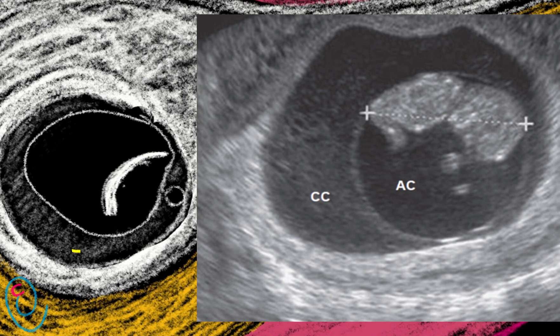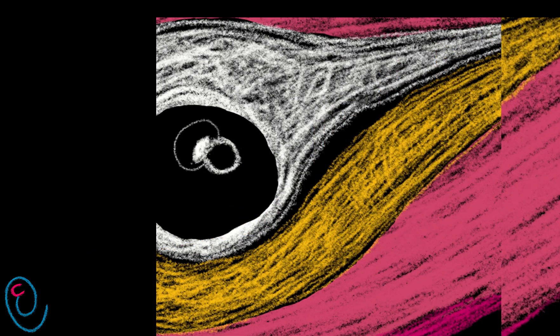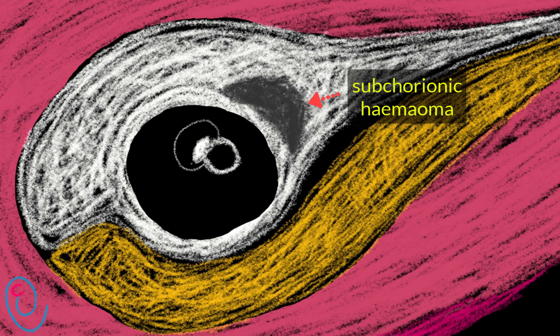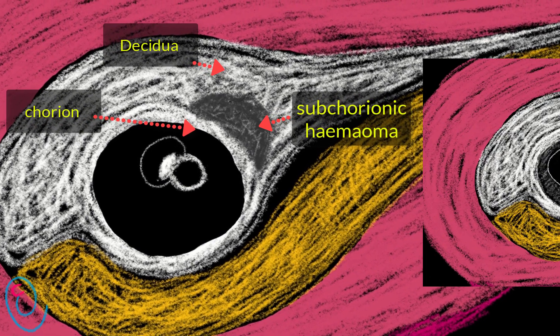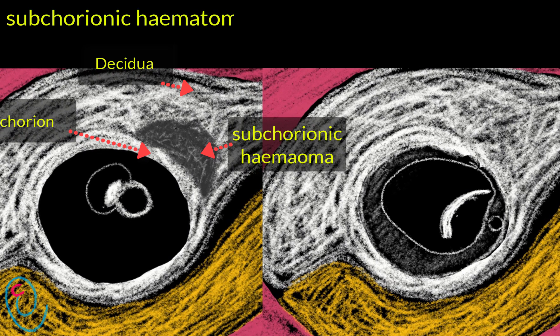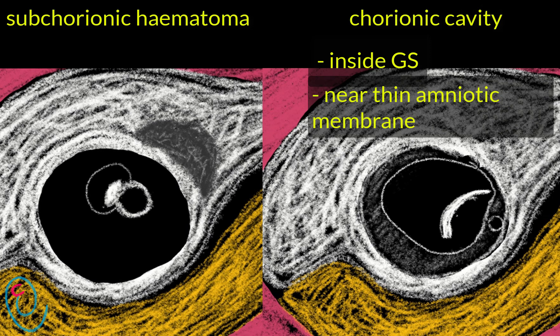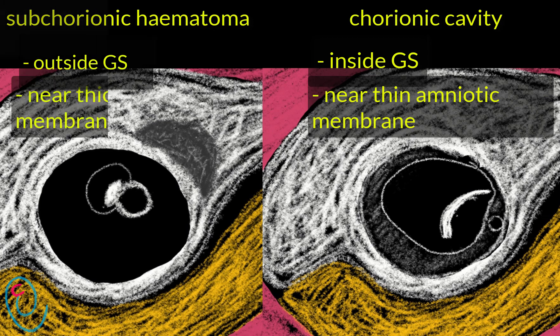The chorionic space may contain internal echoes, and in such a case it may be misdiagnosed as subchorionic hematoma. Subchorionic hematoma is a blood collection between the chorion and the decidua. The difference is that the chorionic cavity is present inside the gestational sac, adjacent to a thin amniotic membrane, while subchorionic hematoma is present outside the gestational sac, adjacent to a thick chorionic membrane.